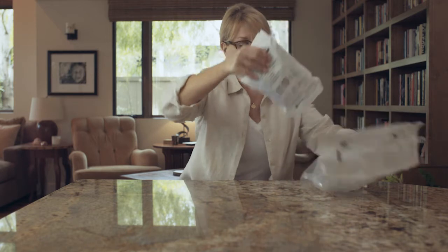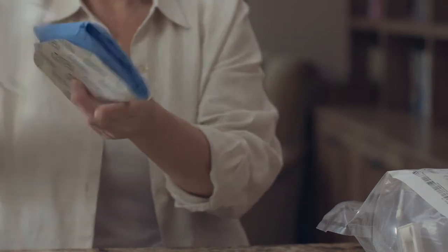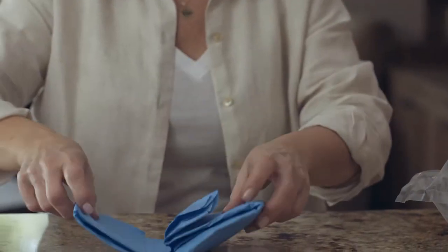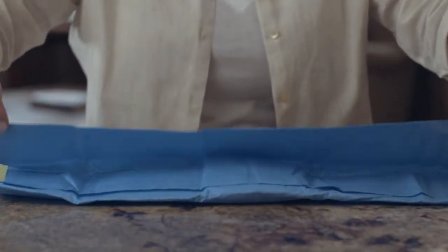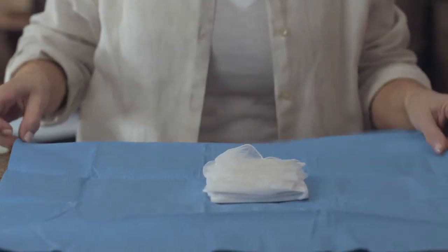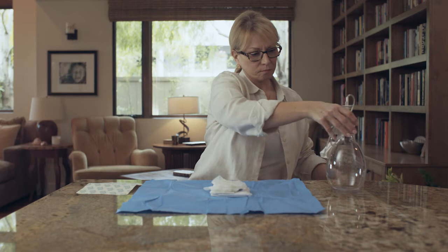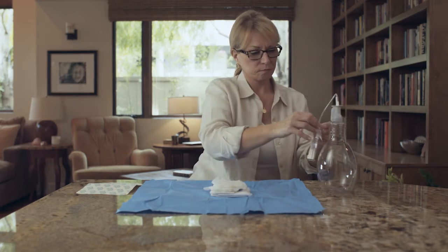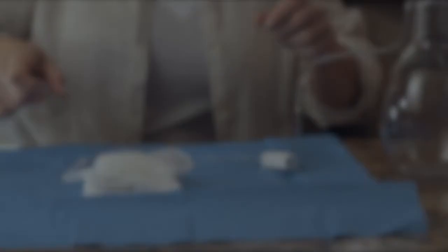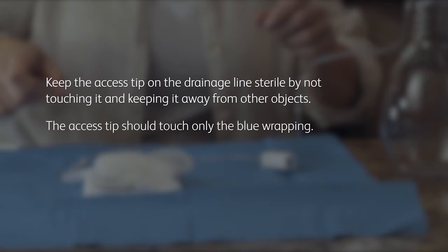First, open the drainage kit bag and remove the procedure pack. Next, open the procedure pack and remove the blue wrapped bundle and adhesive dressing. Set the adhesive dressing aside and place the blue bundle on your workspace with the folded side up. Carefully unfold the blue wrapping by pulling on the outer edges of the bundle. The items inside are sterile, so avoid touching them. The inside of the blue wrapping provides a clean work area. Remove the drainage bottle and connected drainage line from the bag and set the bottle on the table next to the blue wrapping. Remove the tape from the drainage line and set the covered access tip on the blue wrap near the other items. Make sure you keep the access tip on the drainage line sterile by not touching it and keeping it away from other objects.